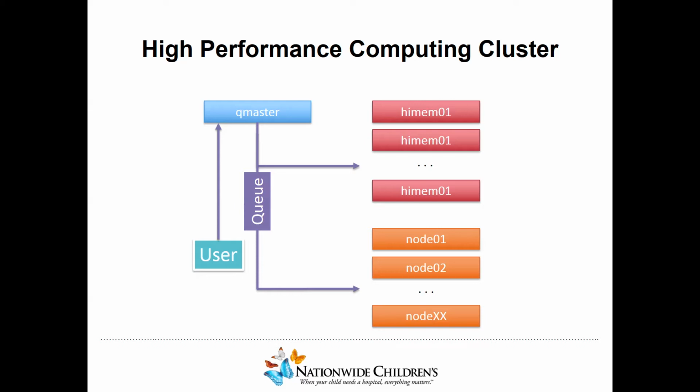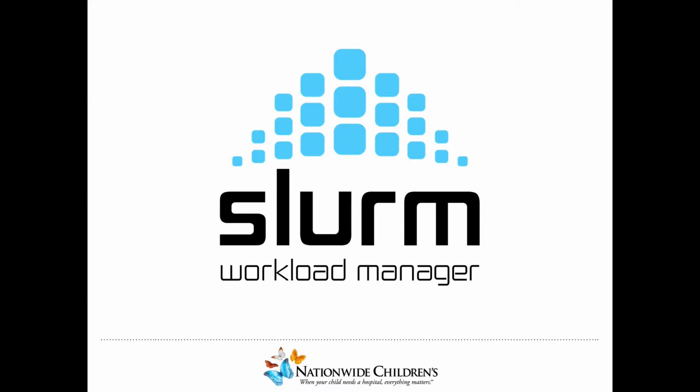As Pavani got me started saying, there's kind of two ways you can do things on the computing cluster. I'm going to focus mostly on the queue system, but you can also use the computing cluster to just look at data and use its resources. So we'll see that part later. But the big thing that they use is a program and a set of systems installed on the cluster called Slurm Workload Manager.